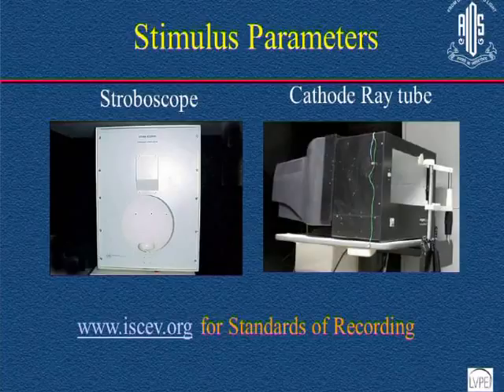Then the type of machine, as I told, and the type of stimulus, whether it's a stroboscope or a cathode ray tube. Different machines will give different types of outputs.